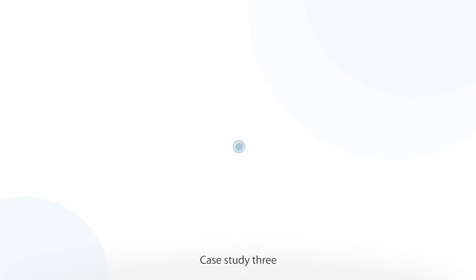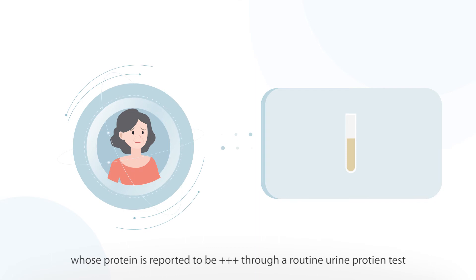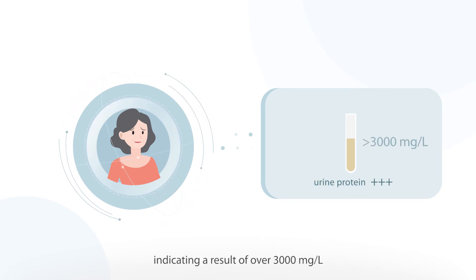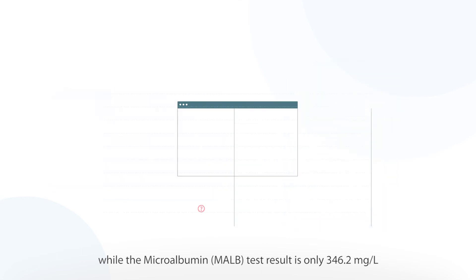Case Study 3: A 60-year-old female patient whose protein is reported to be triple plus through a routine urine protein test, indicating a result of over 3,000 mg per liter, while the microalbumin test result is only 346.2 mg per liter.